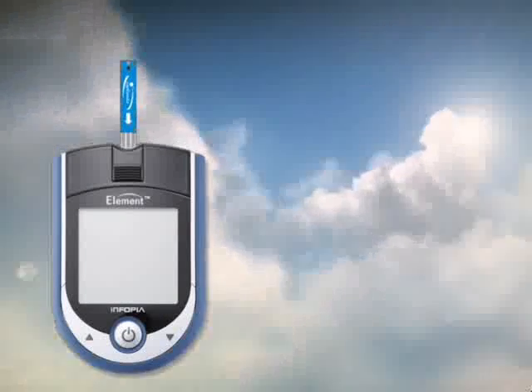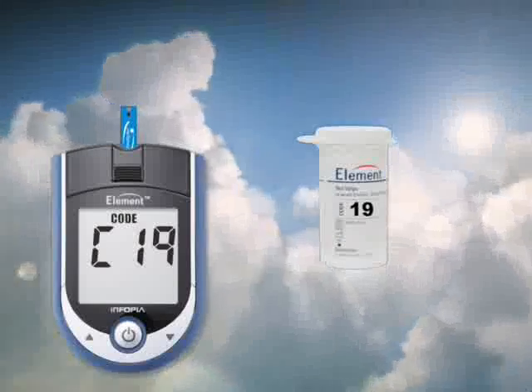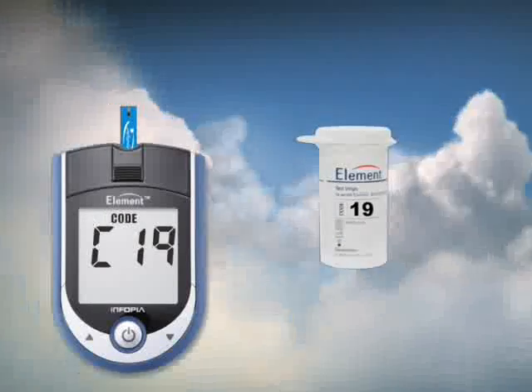Pull a test strip out of the bottle and insert it into your meter. Your meter will automatically recognize the test strip code number and adjust the meter accordingly.